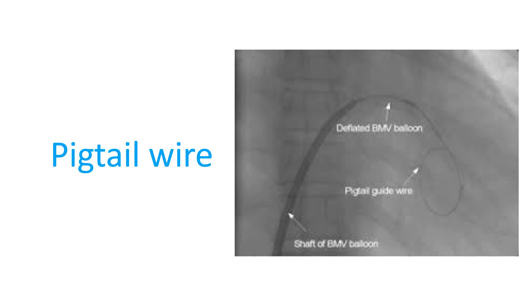Then the Mullins sheath is removed and a septal dilator is threaded over the wire. The septal dilator is passed to and fro across the inter-atrial septum a couple of times to ensure adequate dilatation of the septal puncture.